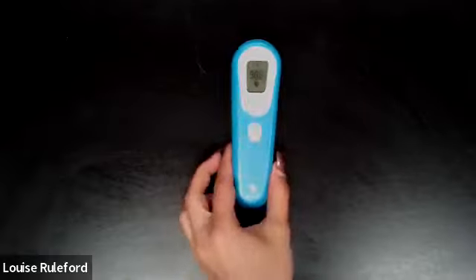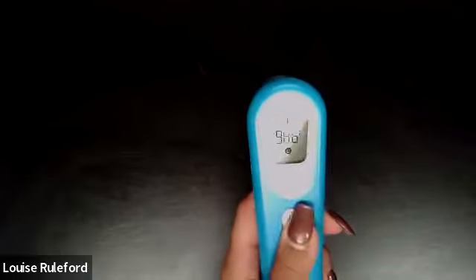Aim the thermometer at the center of the forehead, approximately one inch away. Then, press the button to take a temperature. You will hear a beep once it has completed.